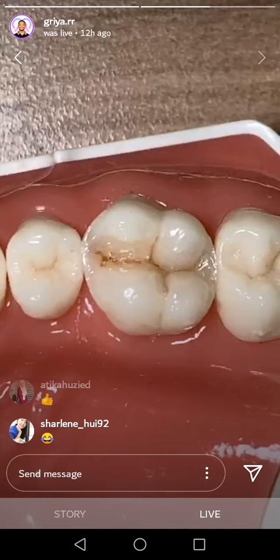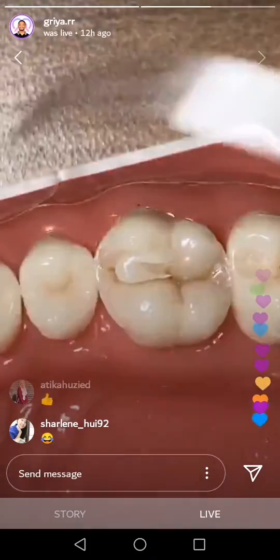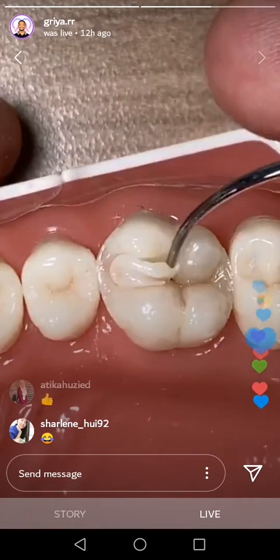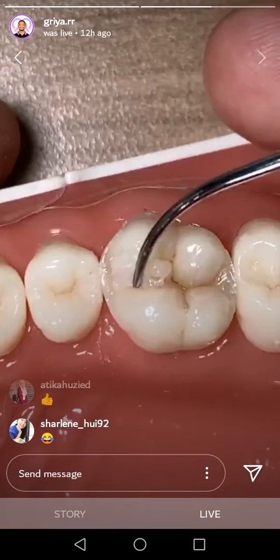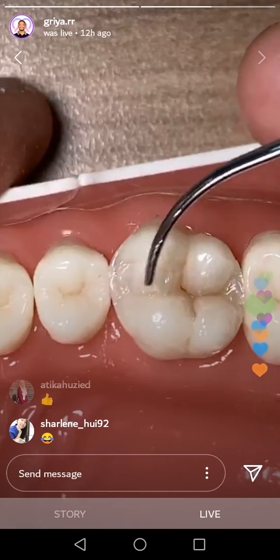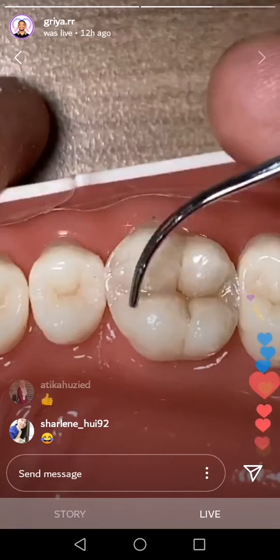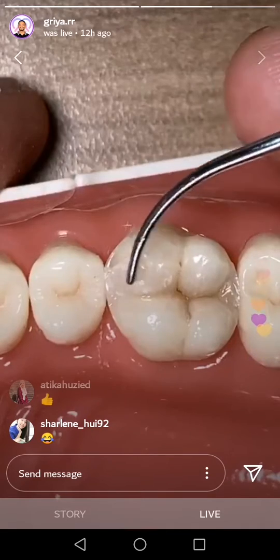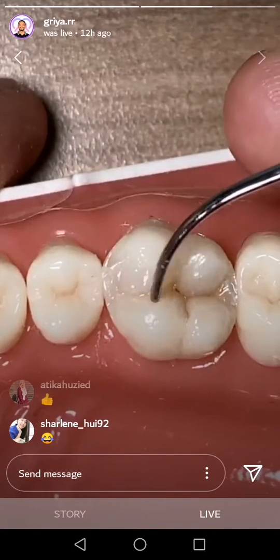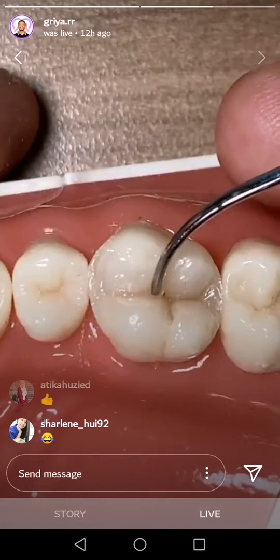So yeah, you have a different style. Every dentist has a different style of carving. But for me, I always do simple anatomy, simple and acceptable. I don't like to add secondary anatomy, so much detailing, because you have a lot of appointments and a lot of patients, so you need to make it simple and faster, with a good anatomy also, correct anatomy.